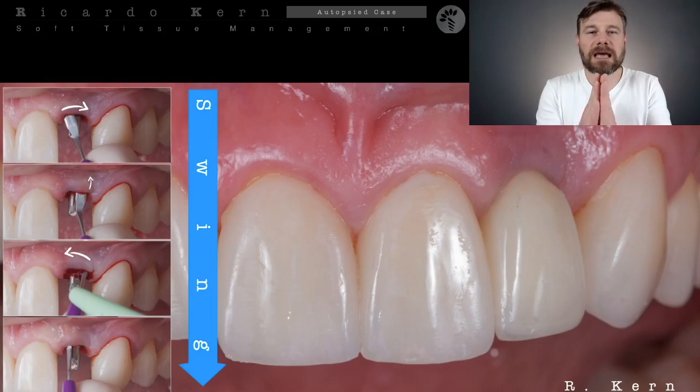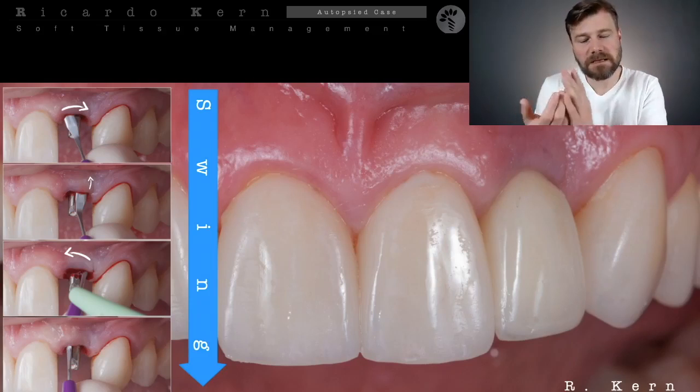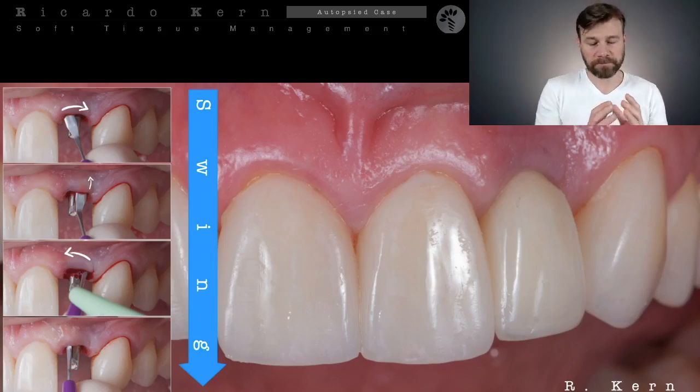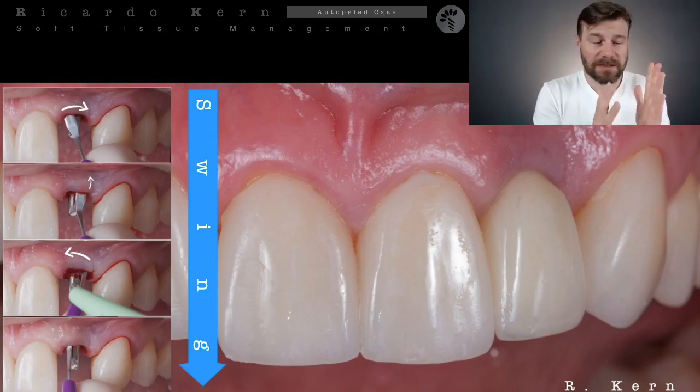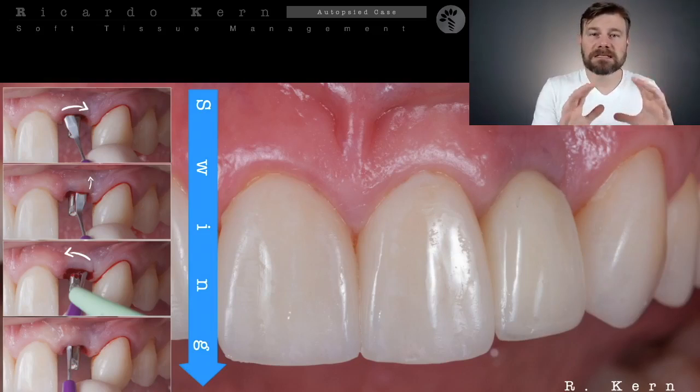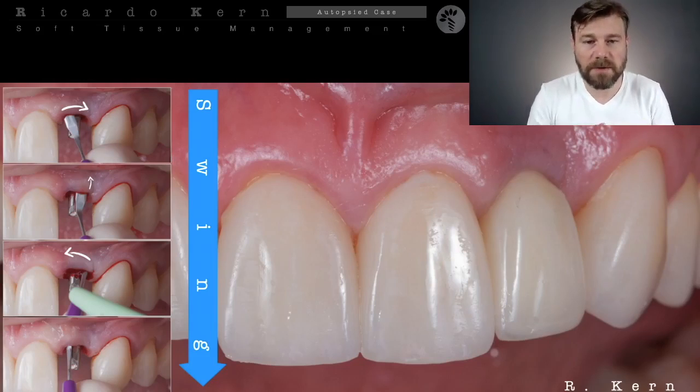We're going to leave as much as possible of the thickness on the surface, but you're still going to leave some parts of the periosteum on the ground, protecting the bone, nourishing the bone on the threads that you may have some exposition, and of course maintaining the biologic width around this abutment and around this implant, okay?